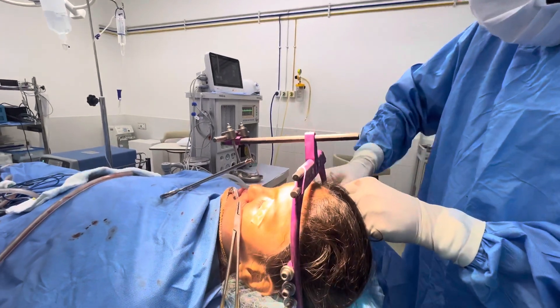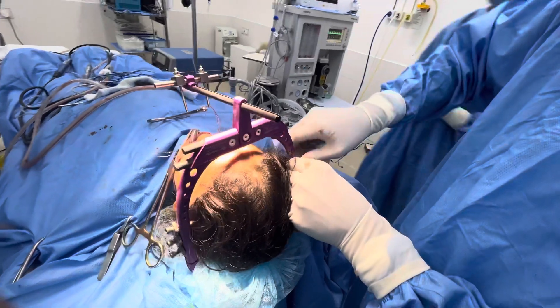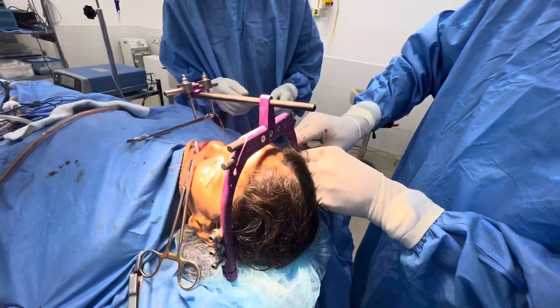These screws need to be tightened a bit more.